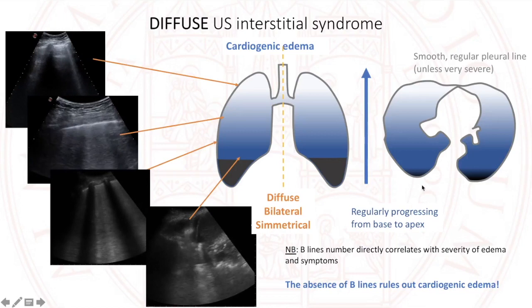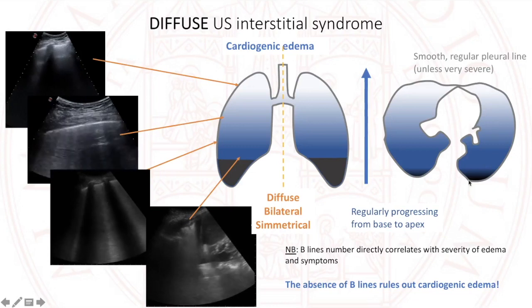The same gradient we could see from the posterior to the anterior part of the lungs if the patient is bedridden for several days, as is most frequent in our medicine wards.